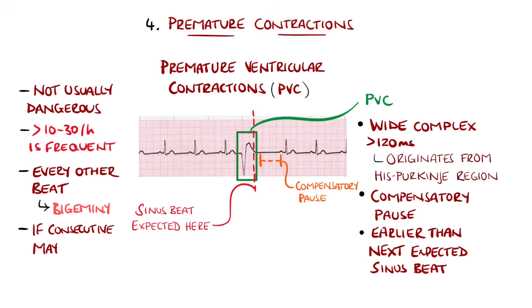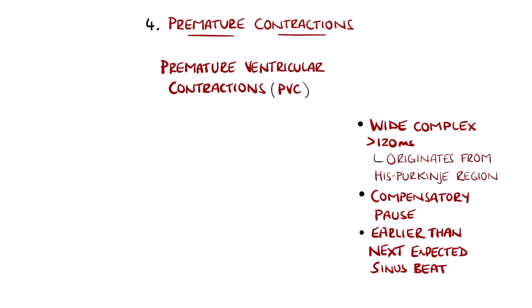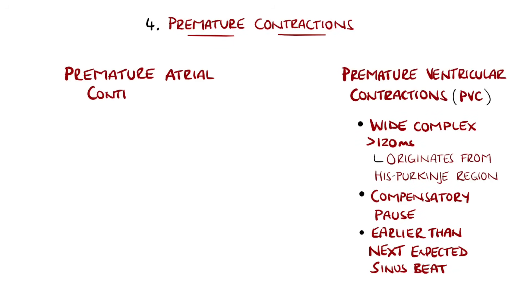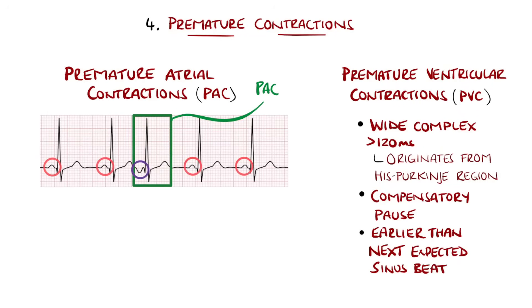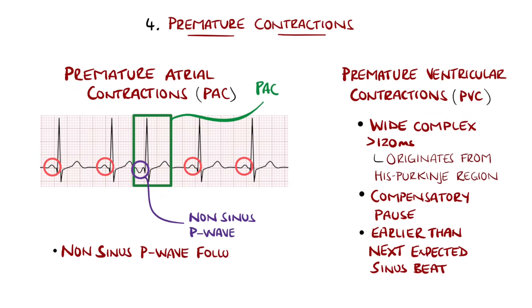A sequence of PVCs one after the other may be described as ventricular tachycardia, which we'll cover later. Premature atrial contractions, or PACs, are seen as a P wave with a different morphology to the regular sinus P waves, followed then by a narrow QRS complex. The beat following the PAC may resemble a pause; however, if you track out the expected location of the P wave, it should fall at approximately the expected time. PACs do not typically require further investigation.